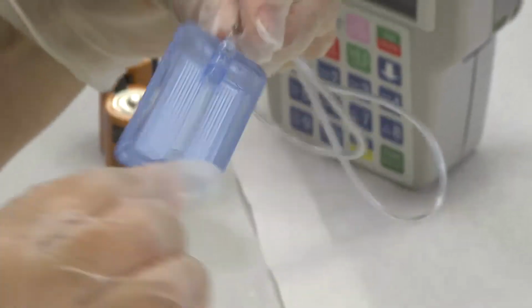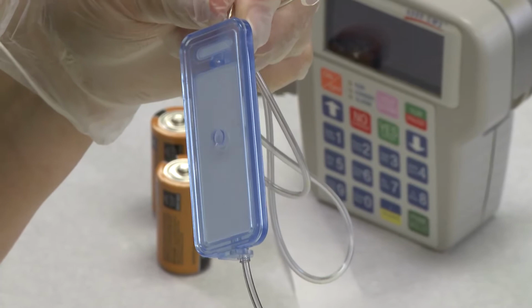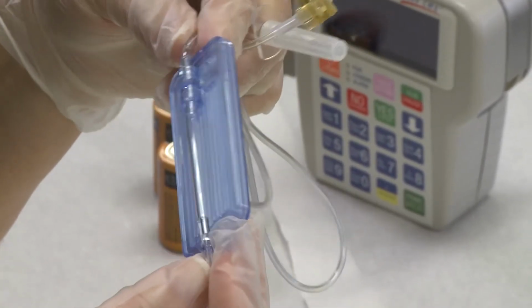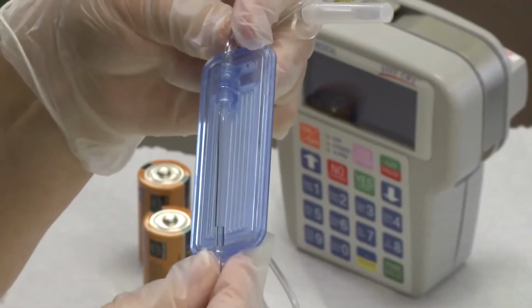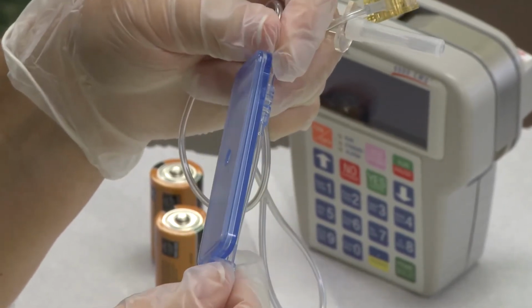This is a filter that as we put the tubing into the bag and the TPN starts to run through, we're going to watch how it fills this filter. This filter collects bacteria, air bubbles. This is a 1.2 micron filter, and we use it on all our TPNs.